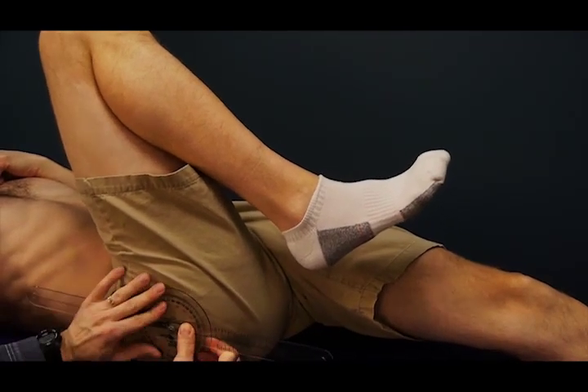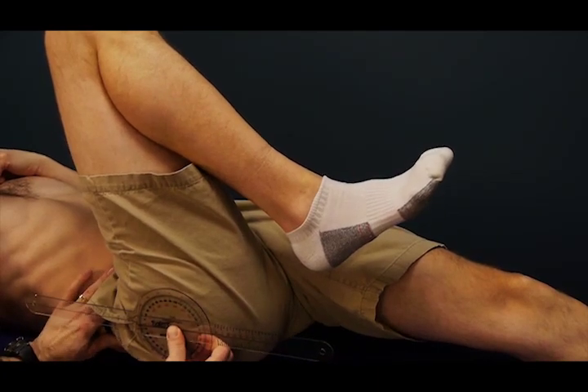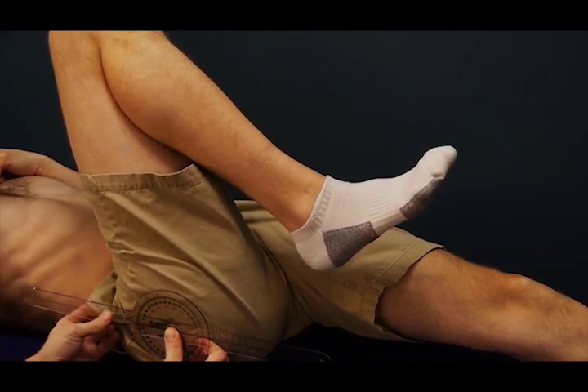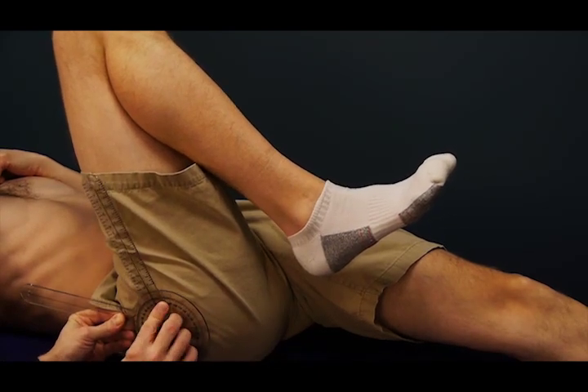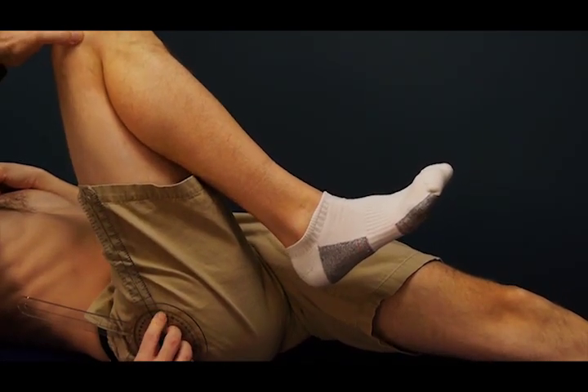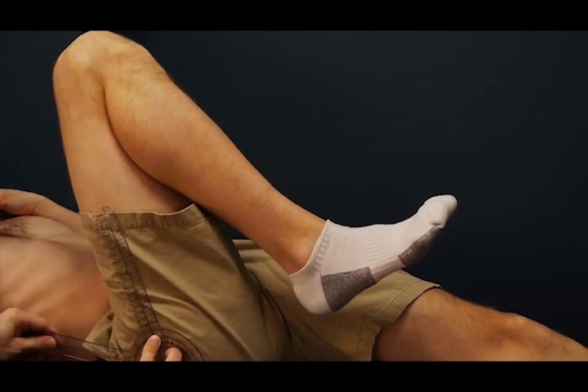Then you repalpate for that greater trochanter. Make sure that you are still in the middle aspect of the pelvis. And your moving arm will line up with, again, that lateral epicondyle of the femur.